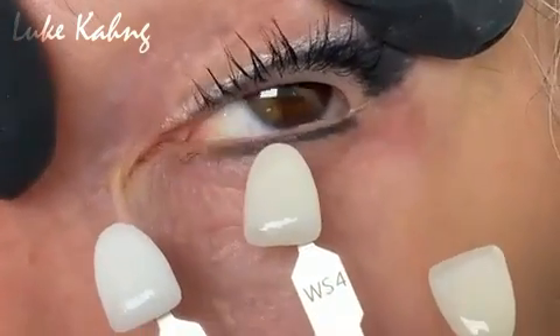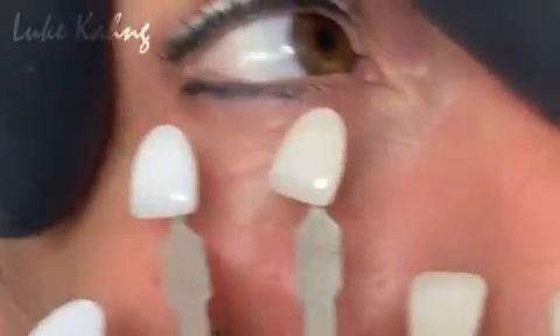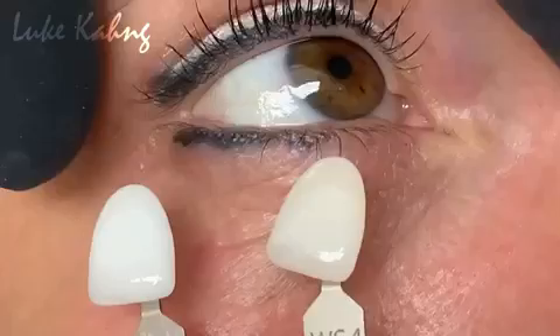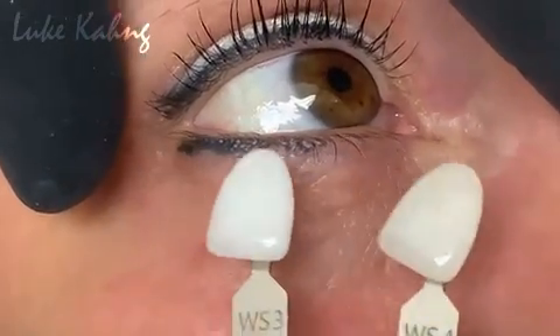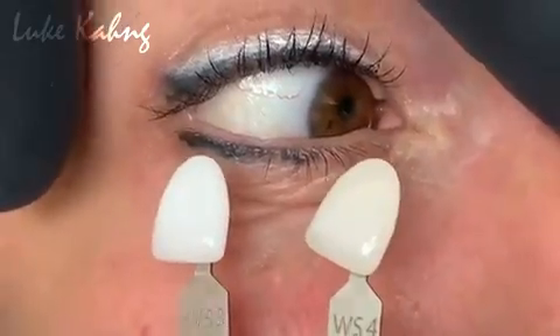If you go too light, you're going to be able to see the difference right away and you're going to know that they're fake teeth. If you go too dark, it's going to look unhealthy. So you've got to find the shade that's in between those two. Beautiful. Do you understand that? That's how I choose.